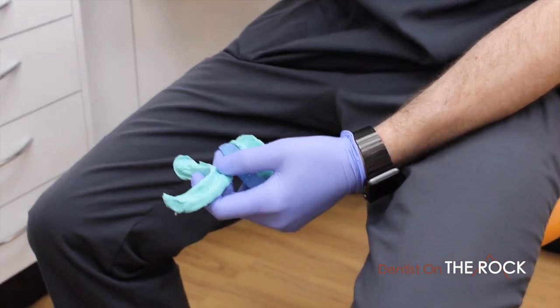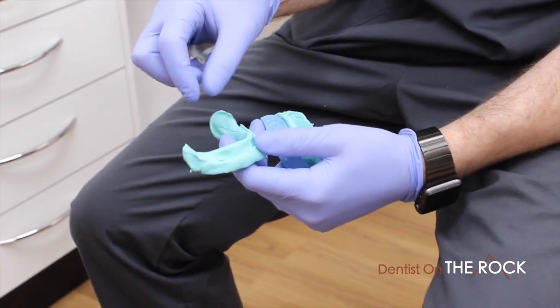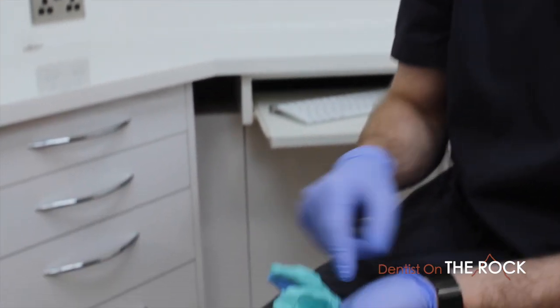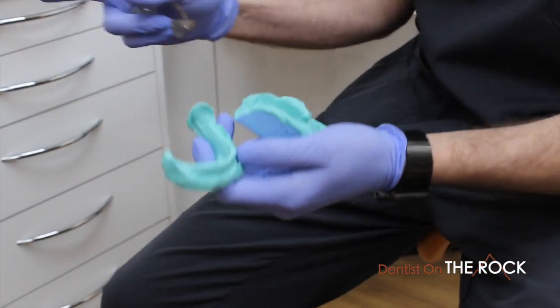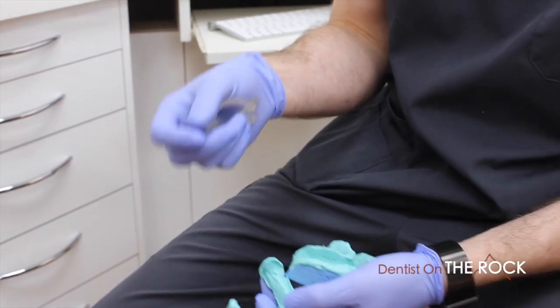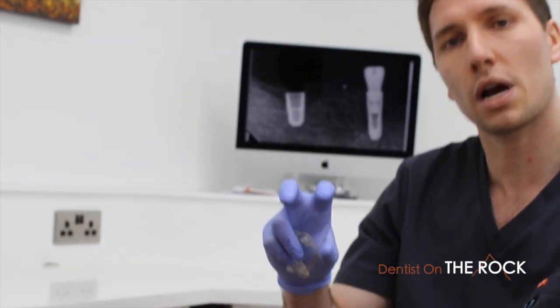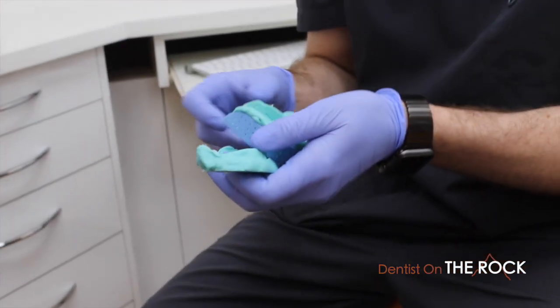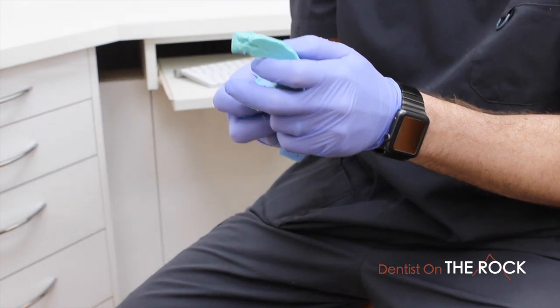We made a denture wax try-in and inserted ball bearings — three into the fitting surface and four into the buccal surface — which are half embedded into the wax try-in. This enables us to take the CT scan with the wax try-in in place. The CT scanner gives us excellent high-resolution images.